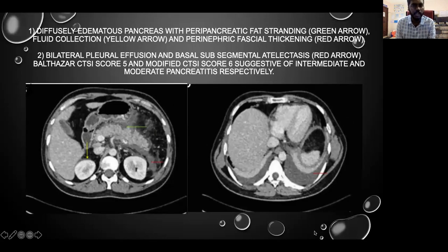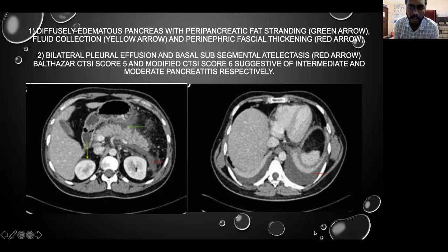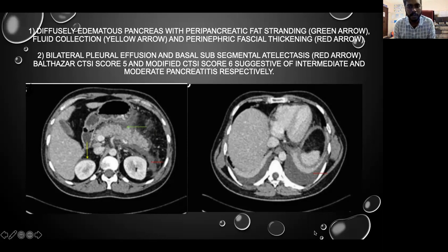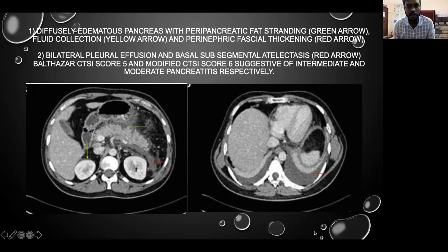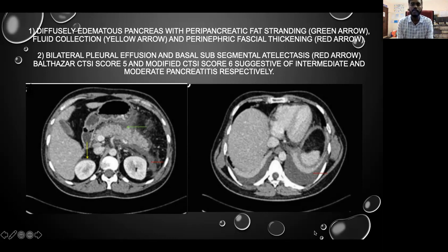The first image shows diffuse edematous pancreas with peripancreatic fat stranding and fluid collections with peripancreatic fascial thickening. The second image shows bilateral pleural effusion and basal subsegmental atelectasis. The Balthazar score was 5 and the modified CT severity index score was 6, suggestive of intermediate and moderate pancreatitis respectively.